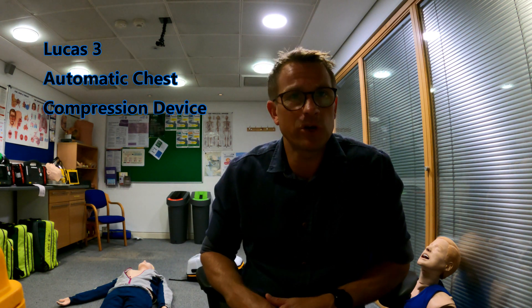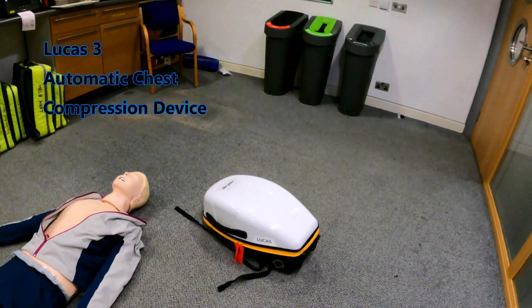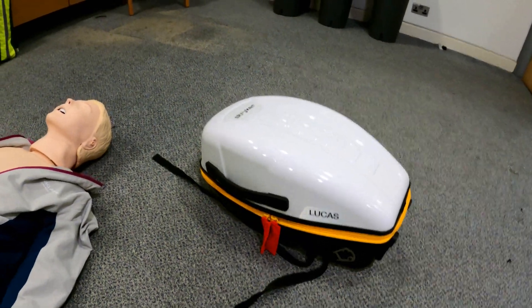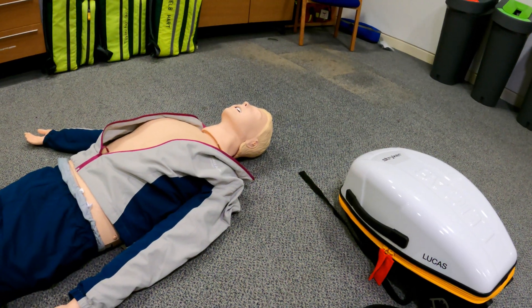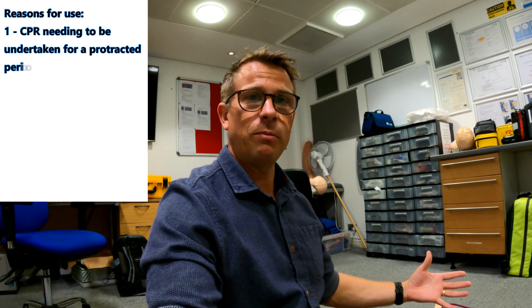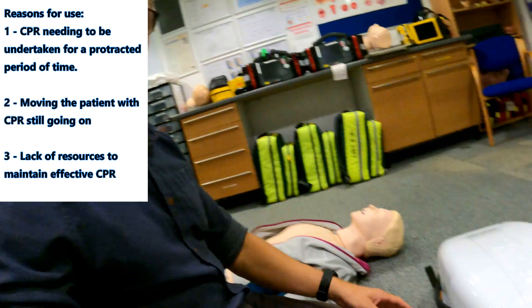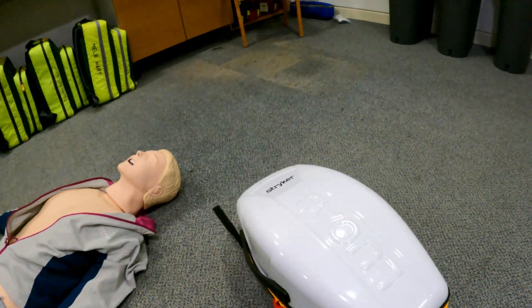For today I'm going to go through our Lucas 3 chest compression device. We use this for undertaking CPR in a cardiac arrest patient. The main reasons we'd use this bit of kit are where you're doing protracted cardiac compressions — so the arrest is going to be going on for a long time — or you have to move the patient, because doing chest compressions in the back of a moving vehicle is dangerous and not very effective. Also, if you haven't got enough resources to adequately manage the cardiac arrest whilst doing chest compressions, that's where this bit of kit really comes into its own.